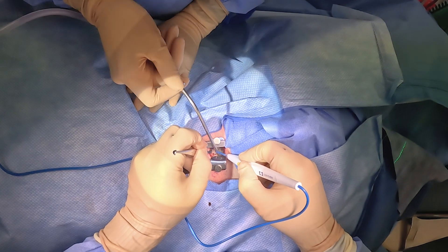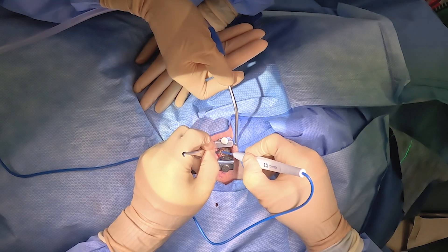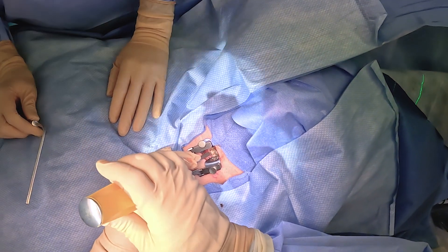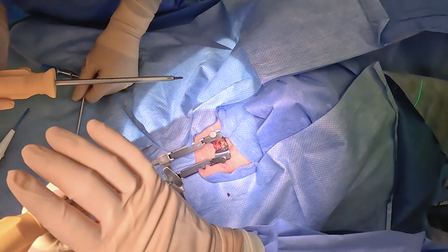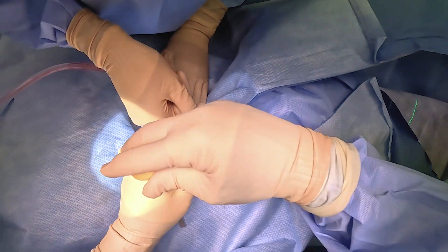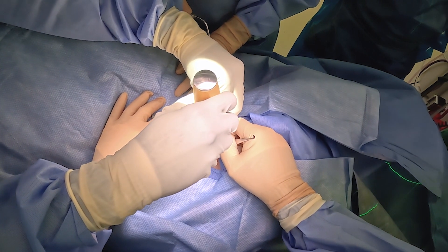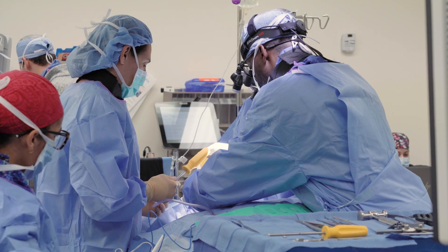With the self-retaining retractors in, we're getting ready to place our pins in the vertebrae above and below, which is a critical component to doing revision disc surgery. This will be the lower pin, and here we go placing the upper pin. And then we'll be placing the distracting device.